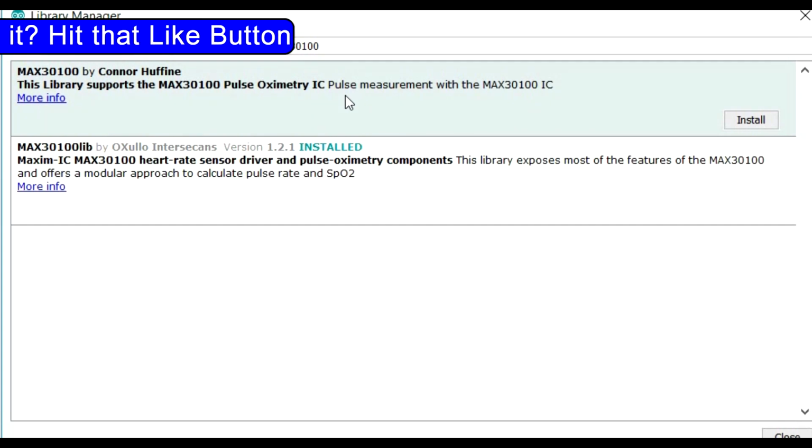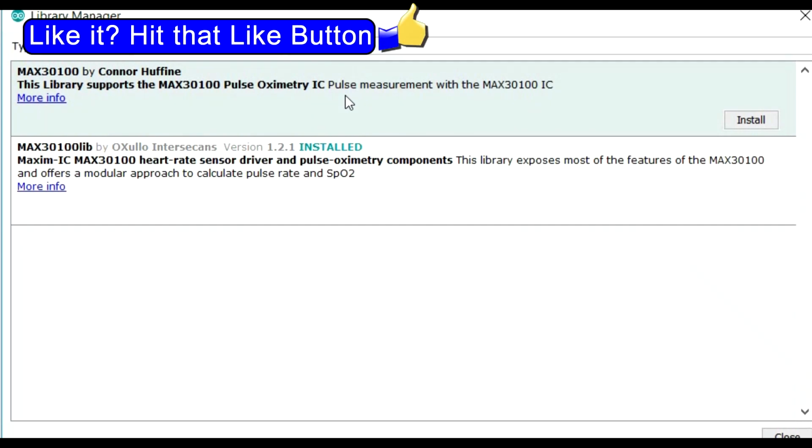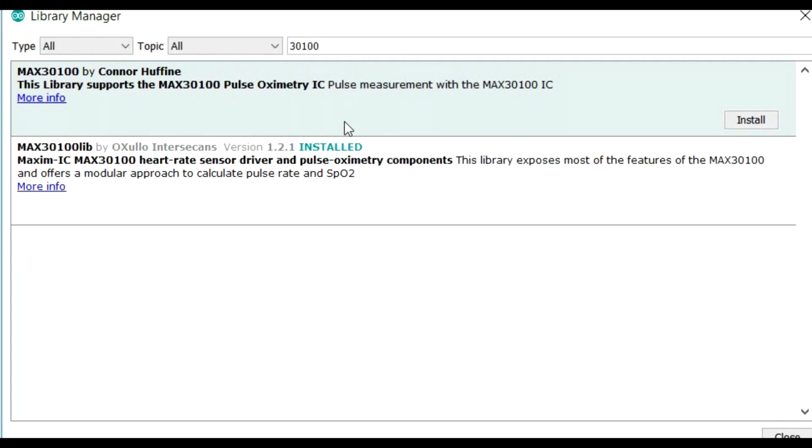It doesn't seem to want to use the D2 pin, that INT pin, and yeah, it just wouldn't work. So the one I find that works is this one, MAX30100 lib. Click on that and then click install. You can see I've already done that, that's already installed, but you just click install and away you go.